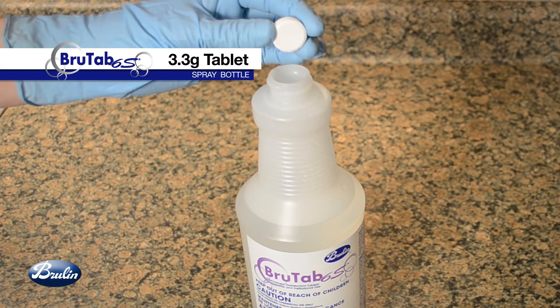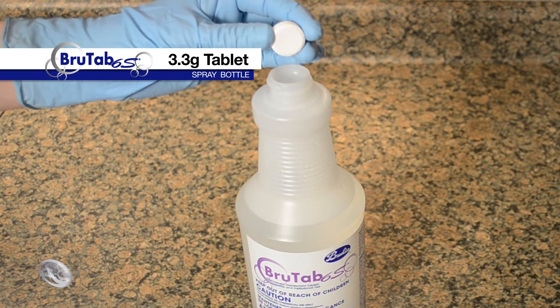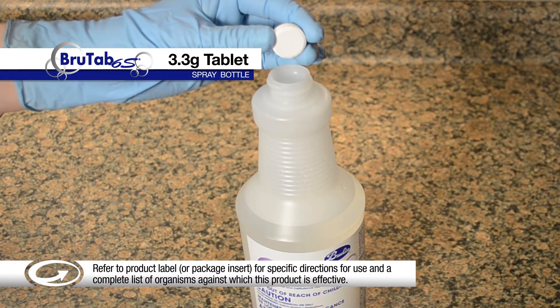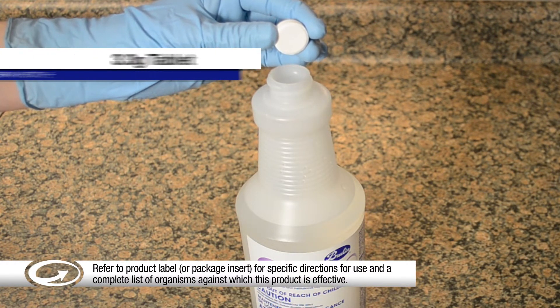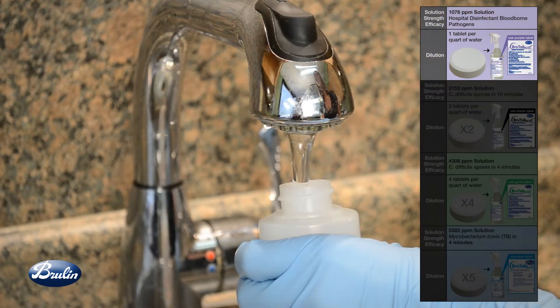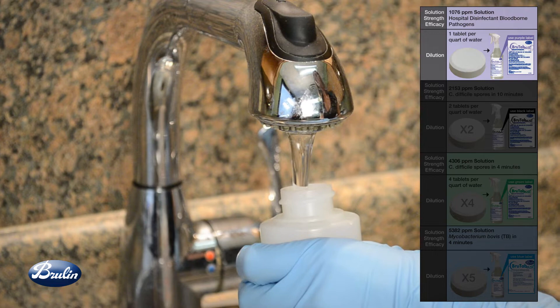Use the 3.3-gram BrewTab 6S tablet to prepare a quart trigger spray bottle with a minimum 1076 parts per million solution for blood-borne pathogens. Fill the trigger spray bottle with water. Refer to this chart for the number of tablets required for the desired solution strength.